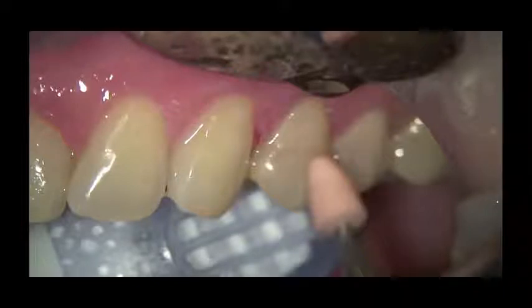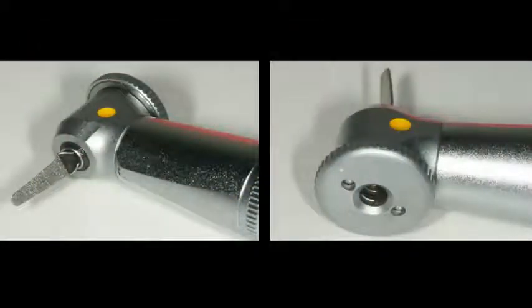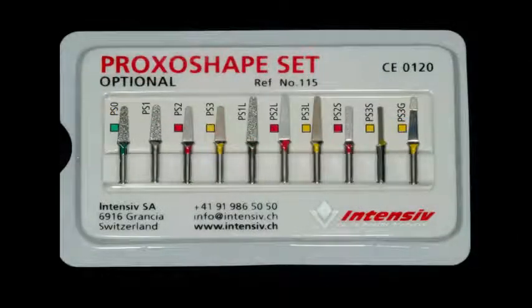Now if you look next, this is the handpiece, and what happens is you put this little blade into the handpiece, and if you look at that dial, you can rotate to the different positions by just turning the dial. So it gives you many, many different positions that you can polish the root surface with. And then this is an example of the product, and you can see the different levels of coarseness. And it's not really marketed well because it doesn't have any kind of decent name, but it's a good product, and as I said, I buy them from Access Dental here in North America.